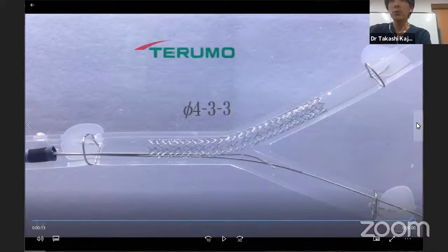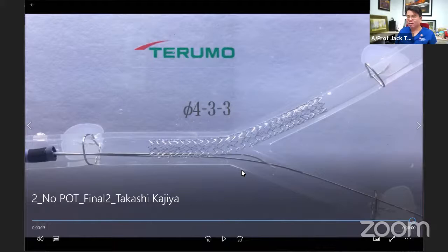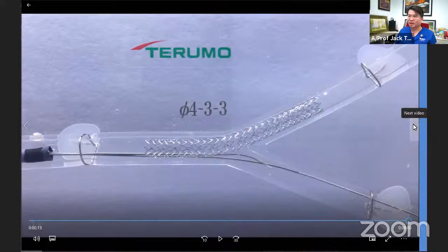So I just want to take a pause here and maybe emphasize that Aaron placed a 3-0 stent in the left main. So for the fellows' sake, this is probably what it looks like. If you did not do a POT and you were too anxious to get back into the side branch, the chances of the wire going under the stent strut or not getting properly into the vessel is very high. So any comments from the faculty on this part?